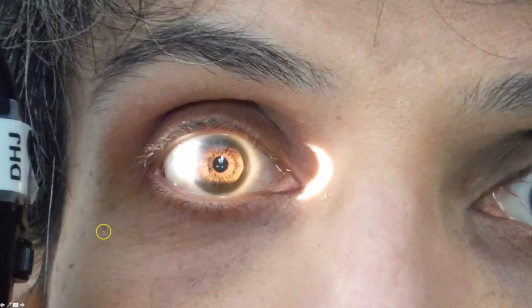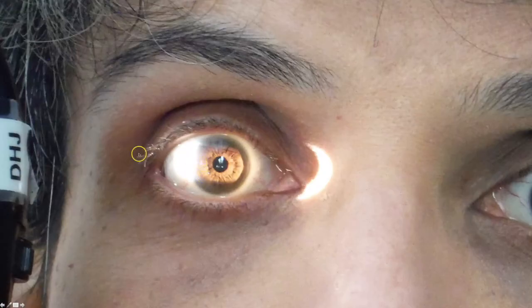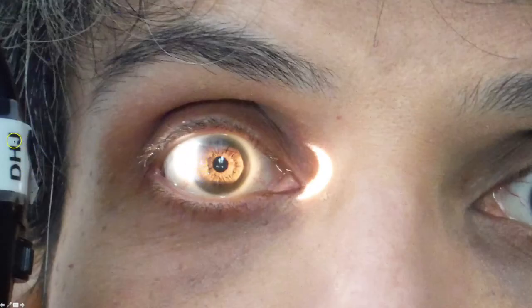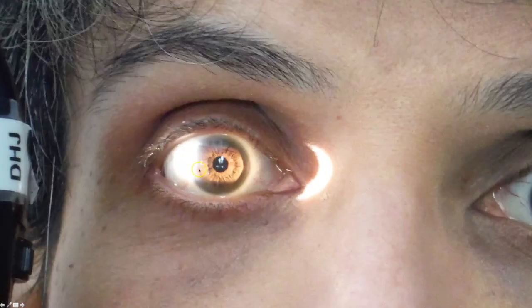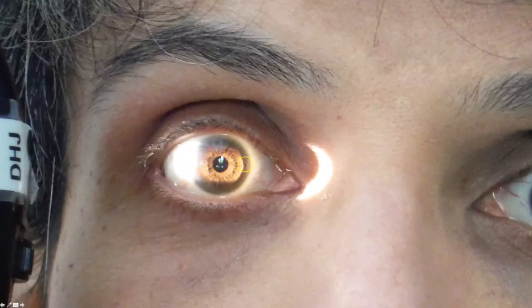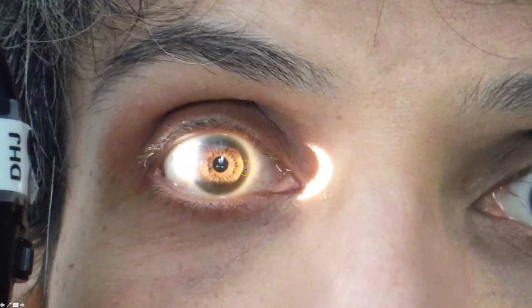Here we see that the anterior chamber is illuminated from the side by this light source. Not only is the temporal iris in view, but also the nasal iris is illuminated.